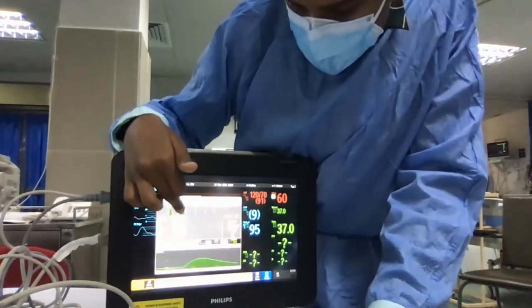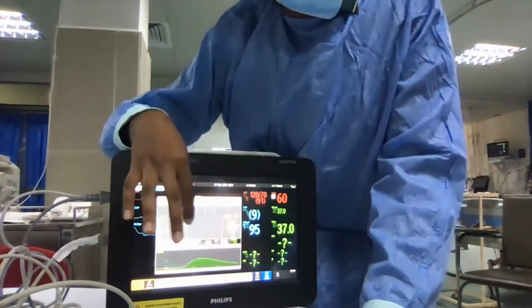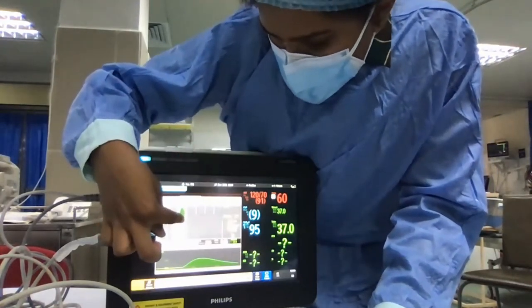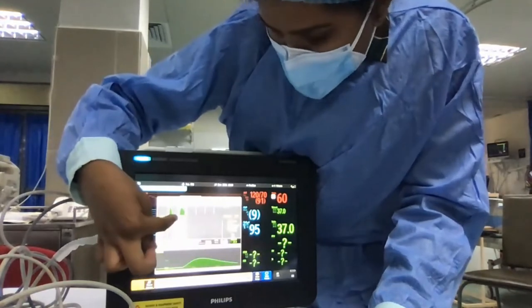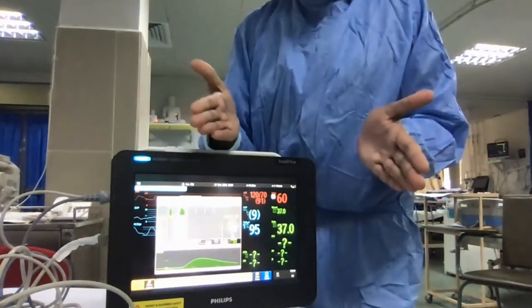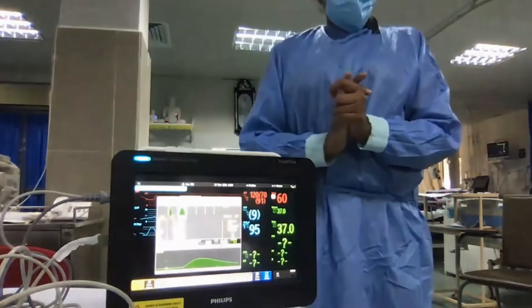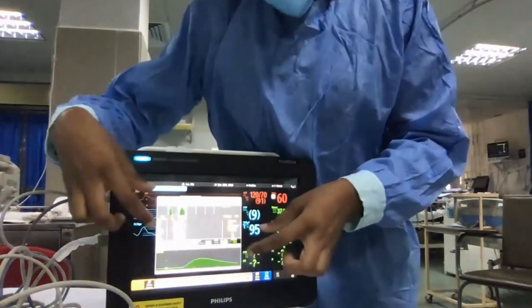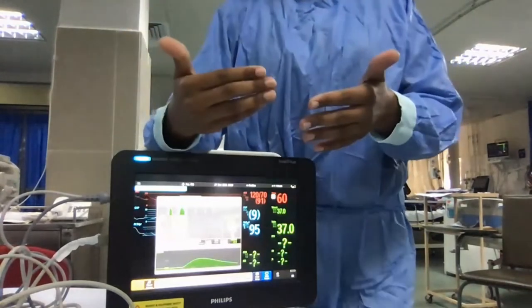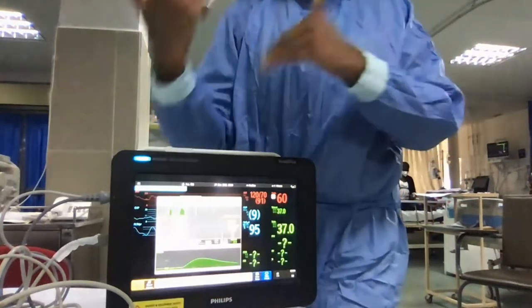Sorry about this, because of the demonstration mode only, this cross mark is appearing. Otherwise, you will get a green tick mark here. The cardiac output is around 5.68, and here 11.4. Madam, there is a big difference between those two cardiac outputs. That is why we recommend you take around 5 measurements. In the calibration, you can get the measurements which are very close to each other to calculate an average.